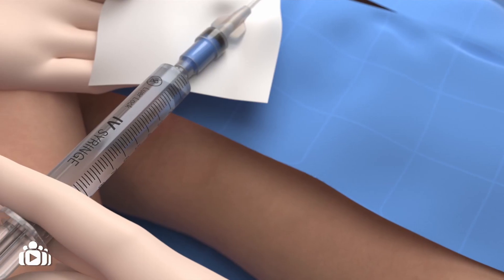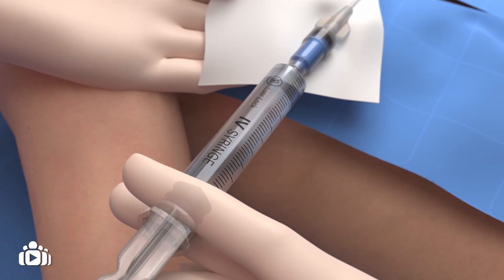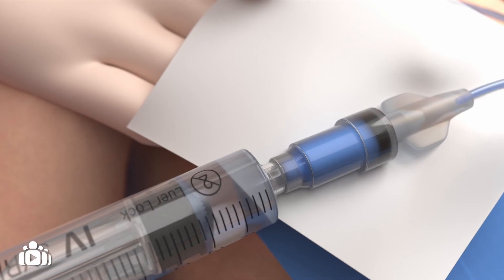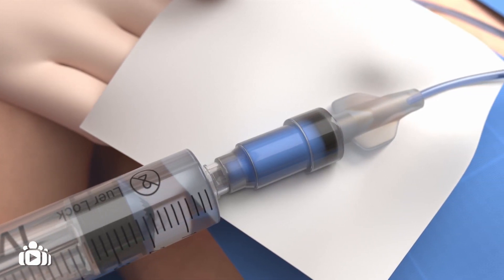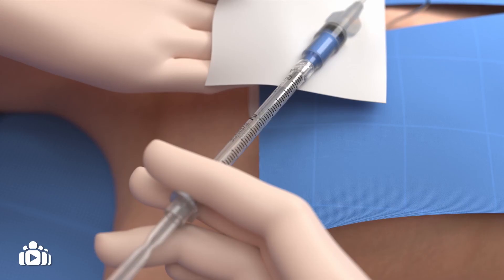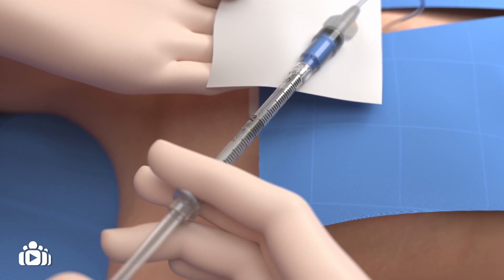Next, inject the saline from the pre-filled saline syringe into the catheter using the pulse rinsing technique — three to four pushes on the 10 ml saline syringe. This is a very important procedure to avoid the catheter being obstructed whilst it is not in use. Then remove the saline syringe. If prescribed, inject the taurolidine lock slowly into the catheter, counting for 5 seconds.